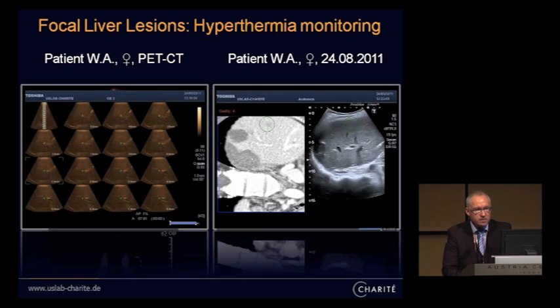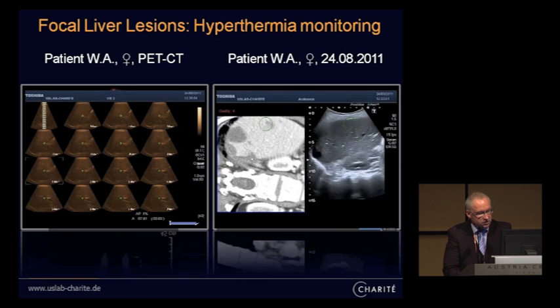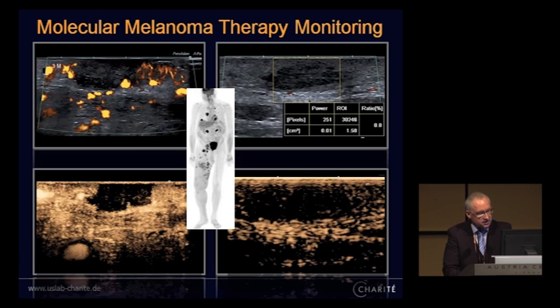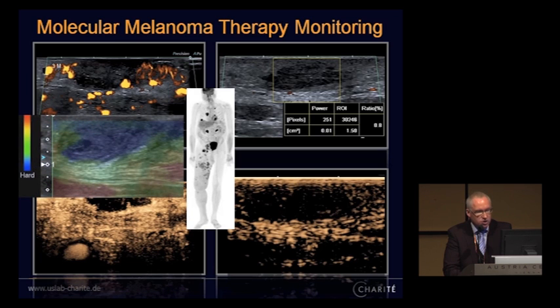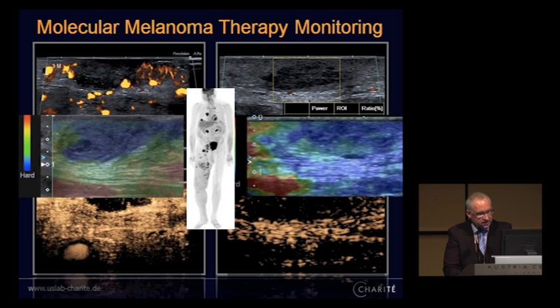So this is another melanoma story where we see a horrible situation based on the PET-CT scan. These are superficial metastases, and we see a hypervascularized lesion with a central necrosis, definitely better visualized for study reasons based on contrast-enhanced ultrasound with a new linear option.